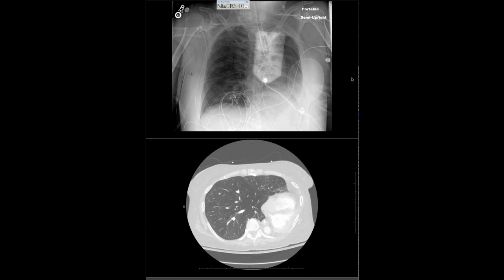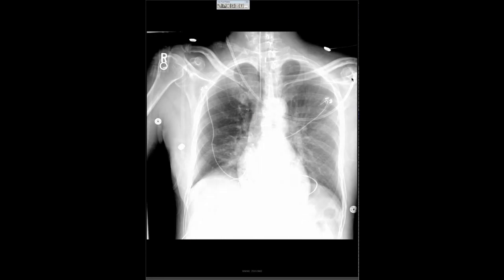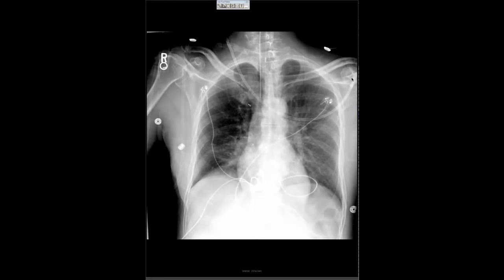Well, interesting discussion. Brian, can you go back to the first radiograph? There's one question I was wondering, because I find the most common cause of asymmetry is just rotation, and one of the clues I use is looking at the axillary soft tissues, because typically if the whole chest is denser, not just the lung, it's because of a rotation issue, versus if it's truly just the lung and you have equal attenuation in the soft tissues, it's probably a layering effusion or differences in density for another reason. Yeah, here's the first radiograph. Hard to tell on this one.